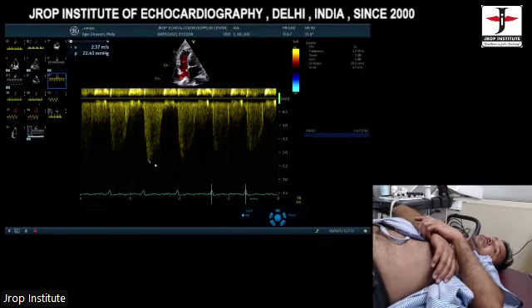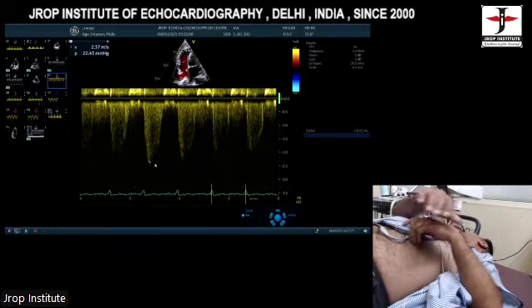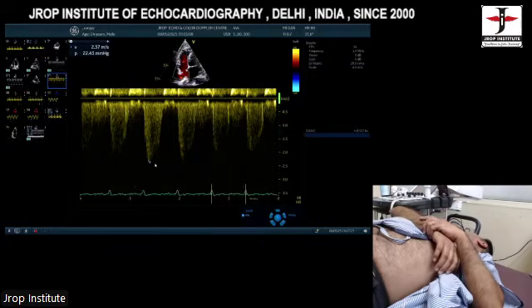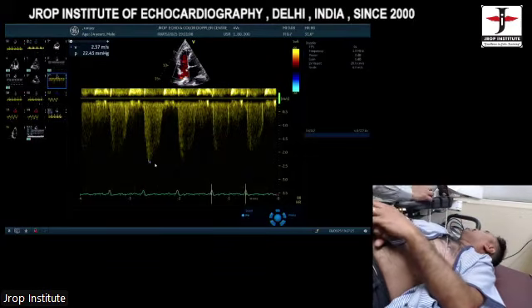Sir, regarding this IVC, please repeat how much the IVC size is and how much pressure we have to take: 5, 10, 15, that thing.